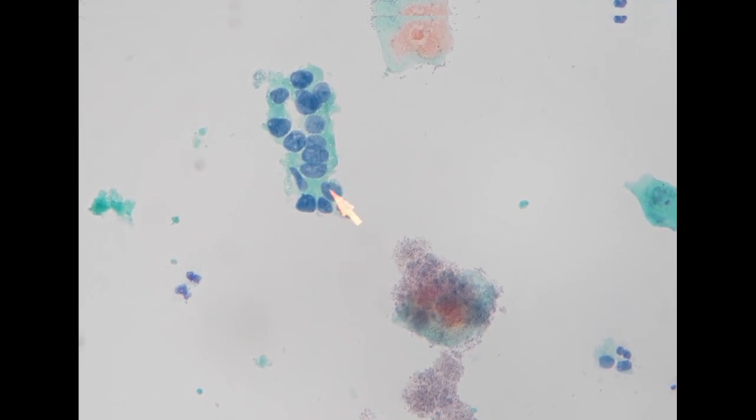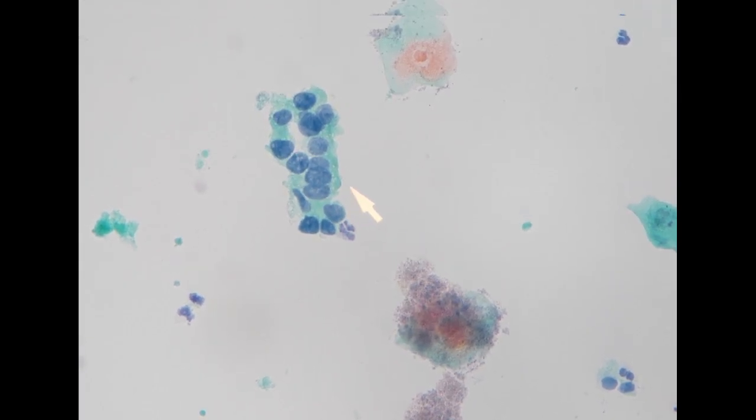However, you can appreciate that these cells do show increased size of the nucleus, a little bit of polymorphism. The chromatin pattern seems to be a little bit coarse, and the cytoplasm is relatively scant. The contour of the nucleus is irregular, so it shows this angulated shape, and it forms a tight cluster. So this cell looks relatively atypical. This is the type of cell that we want to see when we do urine cytology screening.